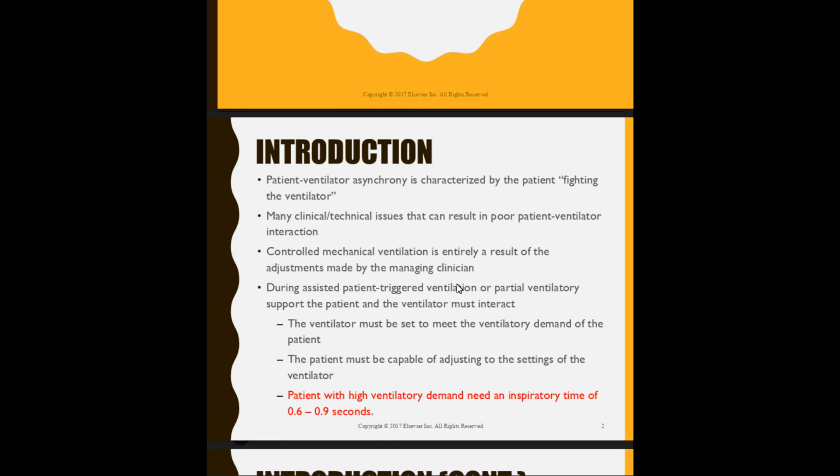That's why when we look at how to put a patient on the ventilator, we do it with ideal body weight, because the ideal body weight actually deals with height, not their actual weight, because it doesn't matter how distended the girth is. It depends on how tall the patient is, because the taller the patient, the more volume that you can ventilate.